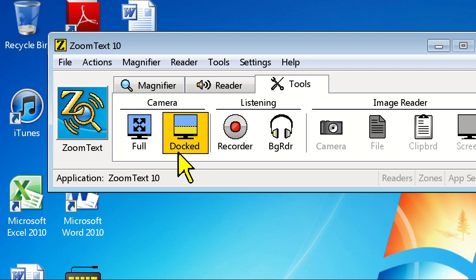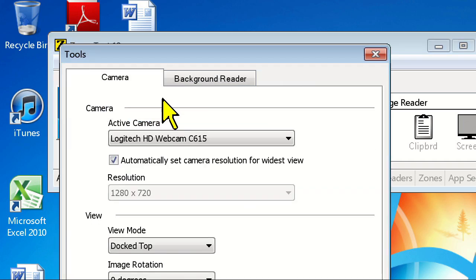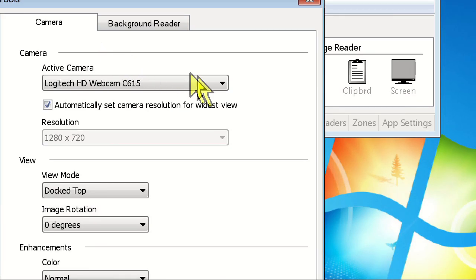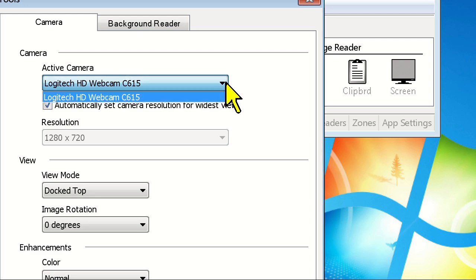Note, if you're using a laptop or have more than one camera connected to your computer, click the Camera heading, or click the Tools menu and go down to Camera, and choose the appropriate device from the drop-down menu and click OK.